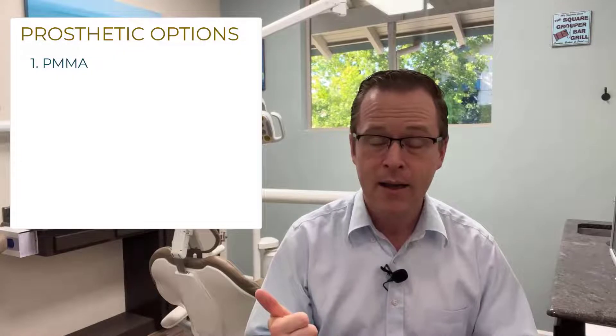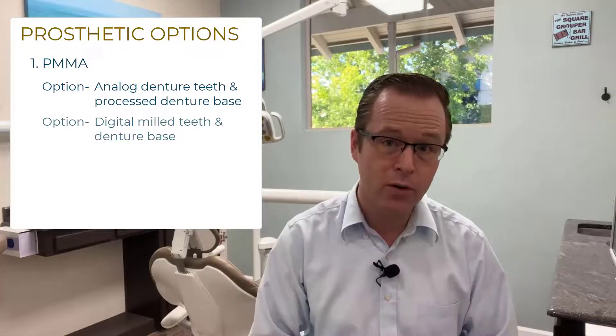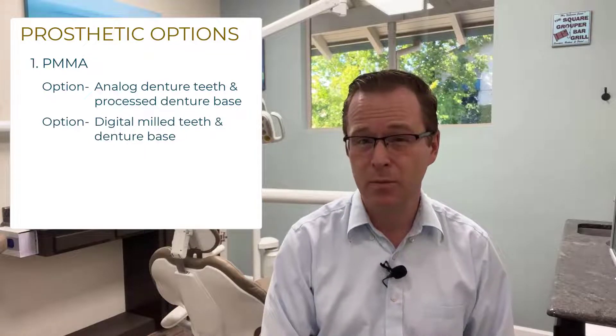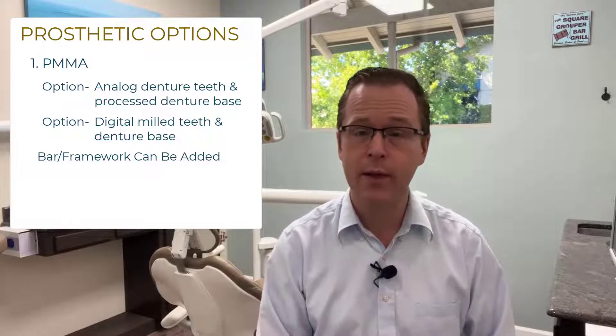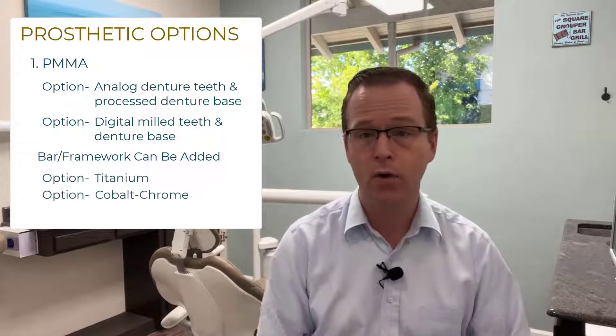Some options of what you can use is straight up PMMA — monolithic PMMA — either with denture teeth with a processed denture base, or milled digital monolithic PMMA from a disc or a puck with layered pink composite. Both of those options can be reinforced with or without a metal titanium or cobalt chrome bar.